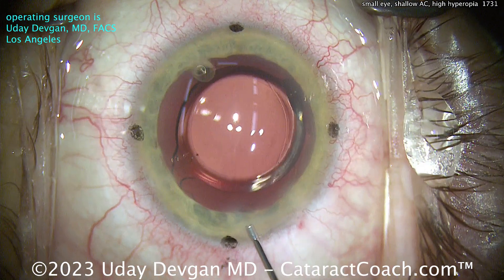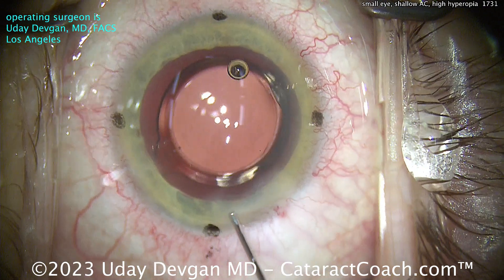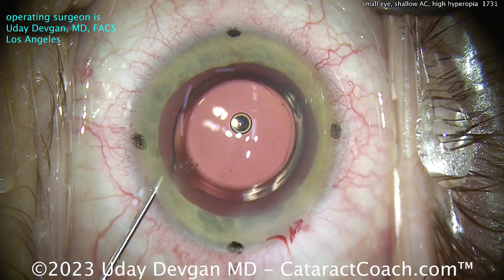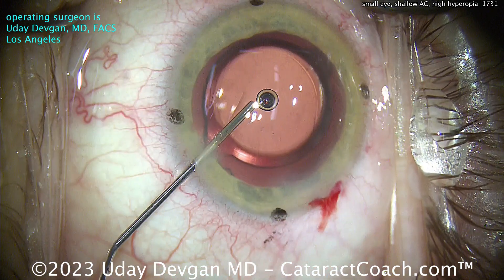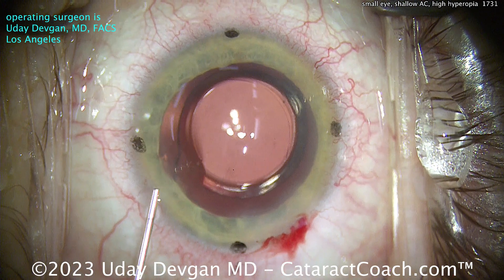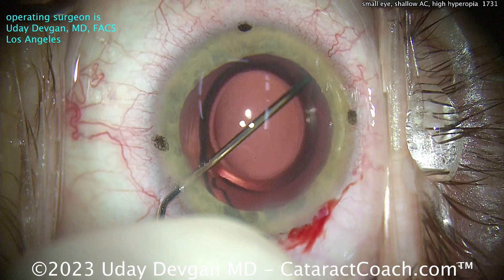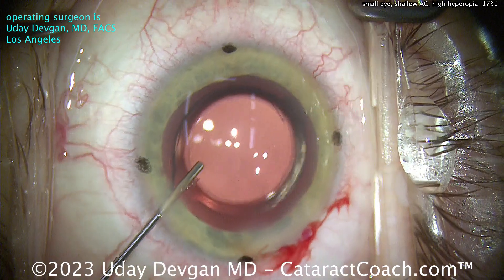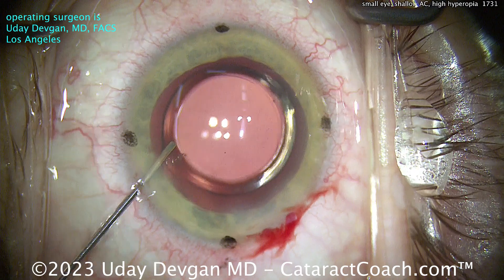This patient achieved the literal ideal outcome. The dominant eye was plano — sharpest distance vision — at 20/20. The eye set for a little myopia for near vision ended up spot on target. At the very end, just a slight final adjustment to lens position, and it is precisely aligned. Sealing up the incision — let's call this a day. This is such a sweet patient, and I'm so appreciative to have patients like this in my practice. It's an honor to be able to change this patient's life forever — taking them from a high degree of hyperopia to truly amazing vision. What a blessing.